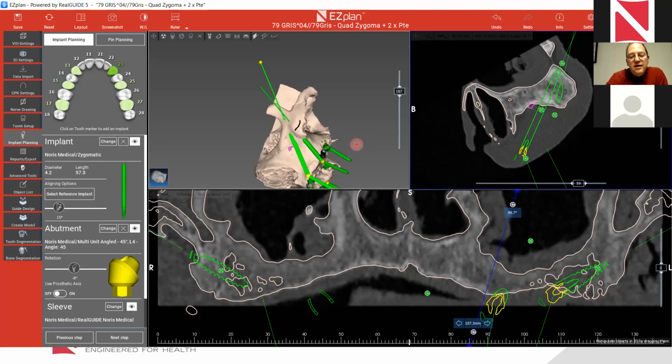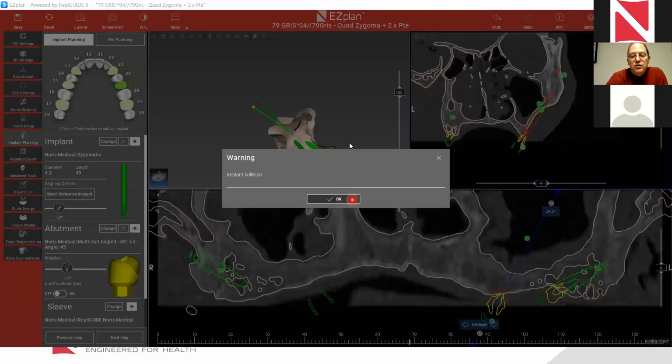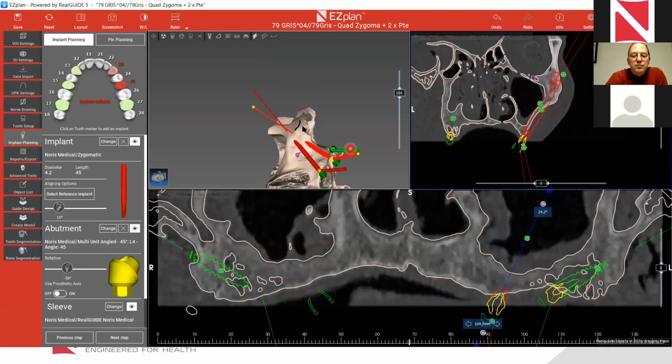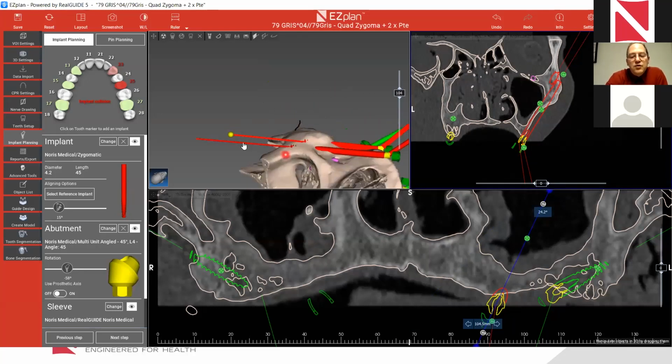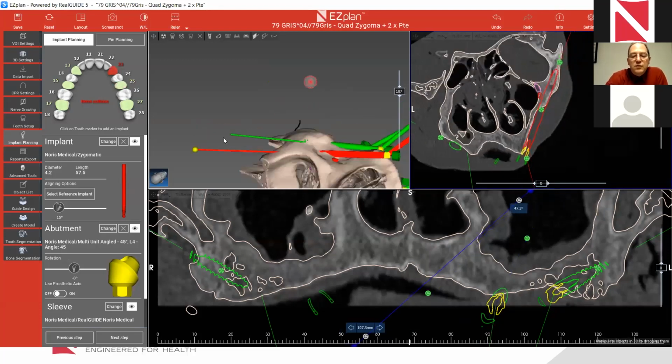implant. But let's say the implant that we did posteriorly first, let's say we put it this way, because we didn't have anything to relate it to. If we did put it this way, then when we come to put the anterior implant, we cannot find a position to put it correctly because we already wasted. We can take the implant towards the orbit like that, and then everything is fine. Okay, but we don't want to do that.